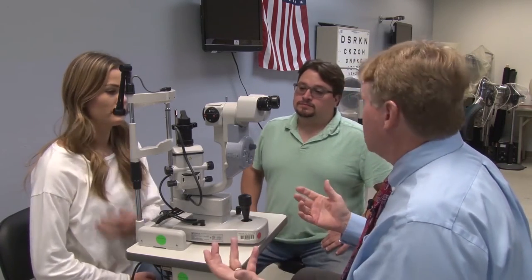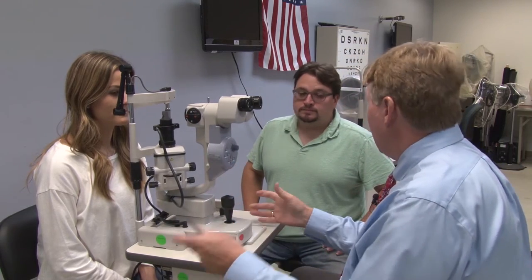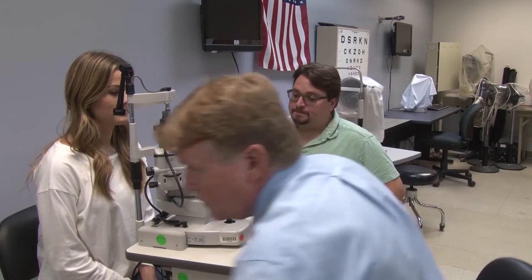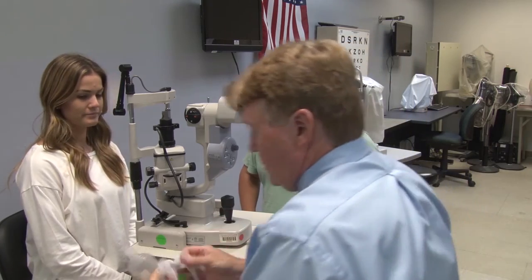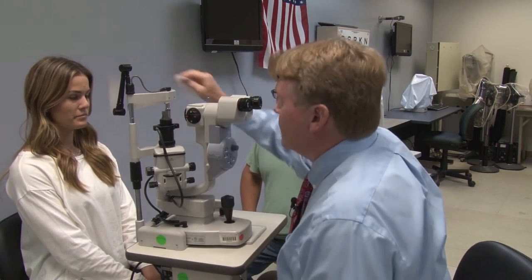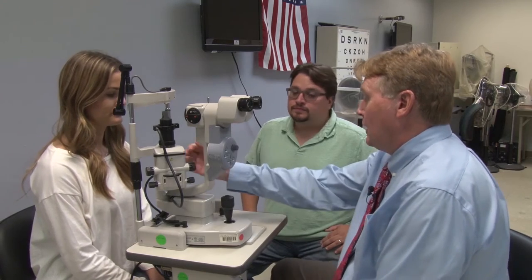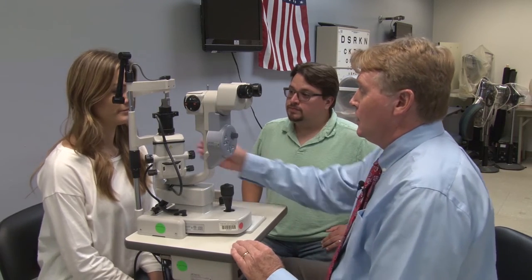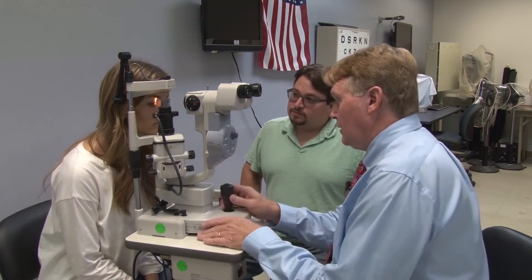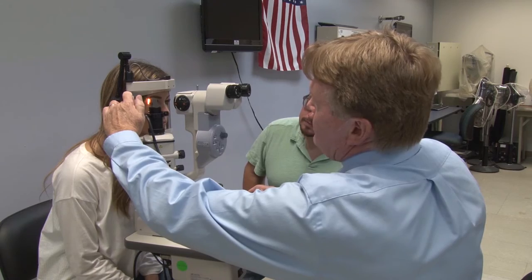The next part is we need to position the patient. We're going to remove the focusing rod and move the whole base of the instrument up and over so we're not blasting her in the eye. We're going to take some alcohol and wipe down the chin rest and head rest. The next step is to position the patient — she's a little taller, so we're going to bring the instrument table up a little bit, chin in here, forehead right up against there. What we're looking for is that her outer canthus aligns with the mark on the slit lamp.